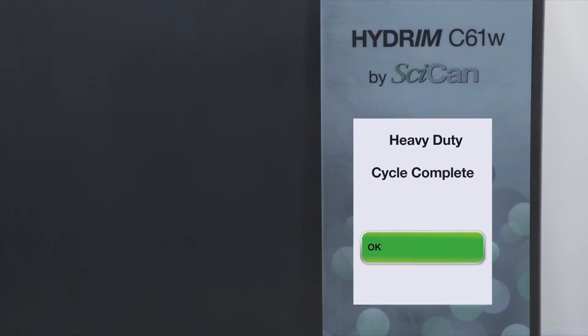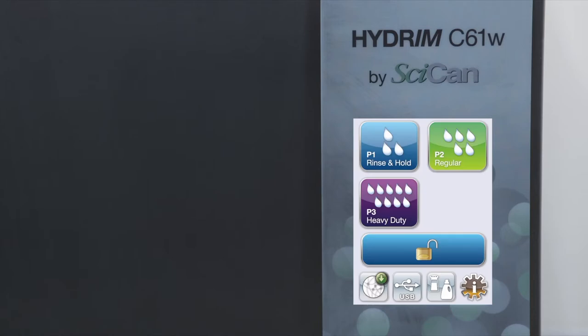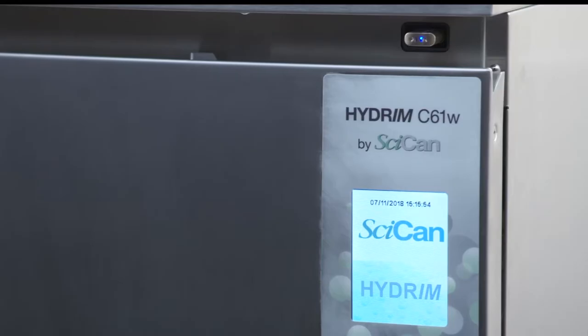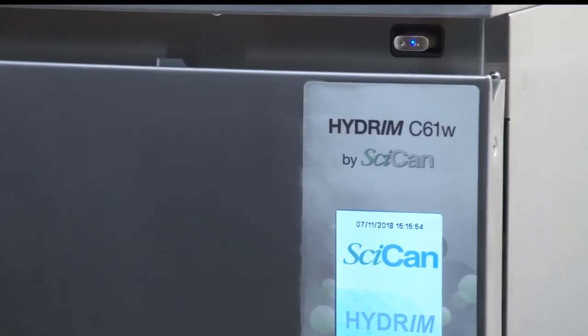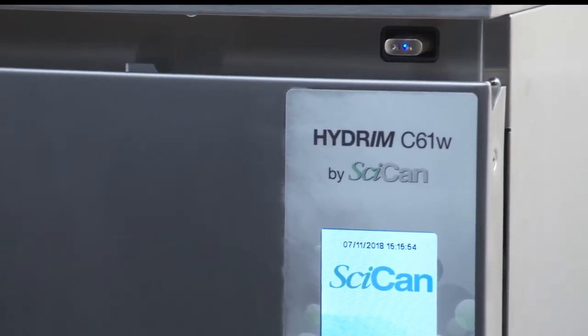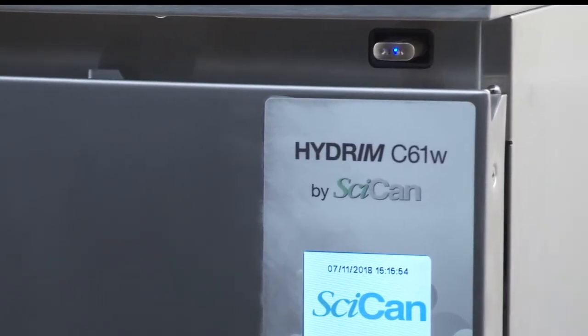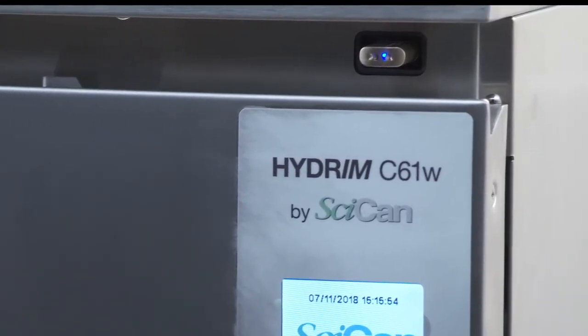Once the cycle is complete, press OK to release the door. Cycle data is automatically stored in the memory and can be accessed later. You can also copy the cycle data on a USB stick and transfer it to a computer for logging purposes.